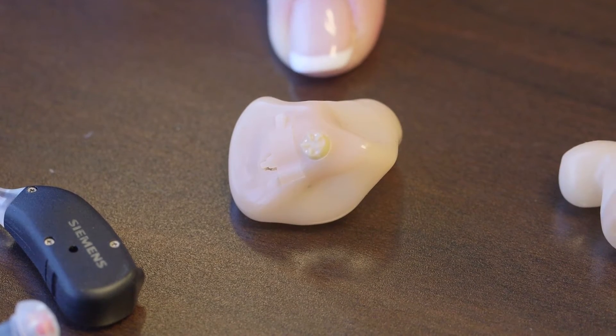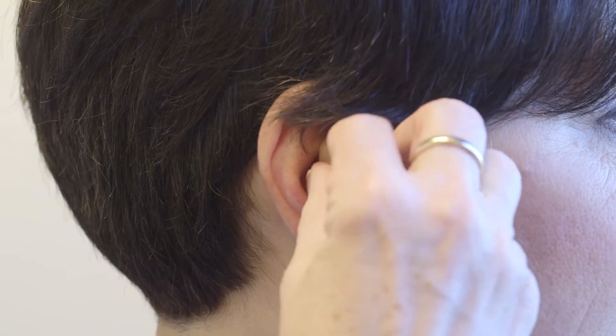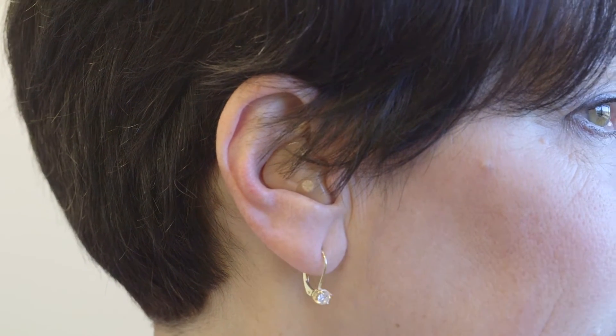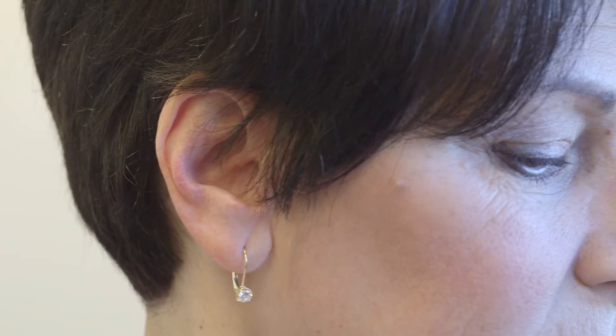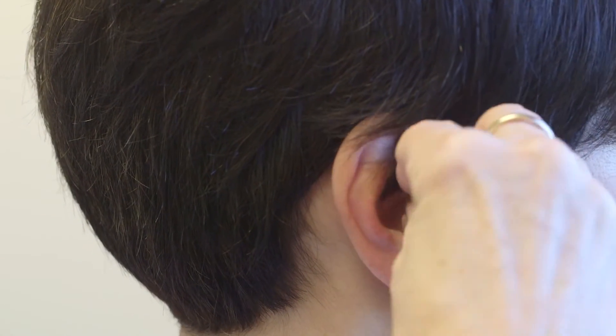Smaller versions of what we call custom hearing aids start with the full shell. These are custom-made — that is, molds are taken of your ears to build a shell that will hold the hearing aid components. As they get smaller, they can be a little bit more challenging to put in the ear canal. This is called an in-the-canal hearing aid.